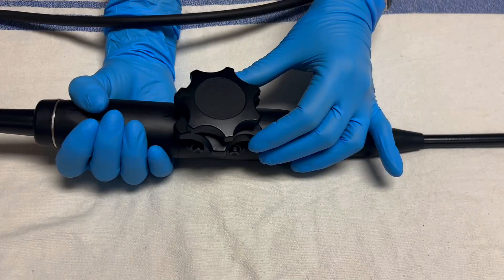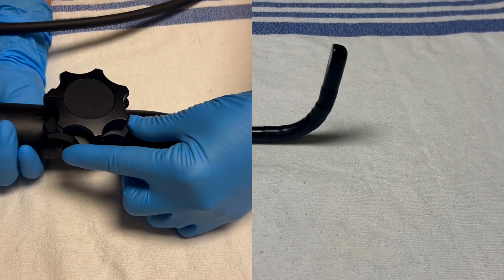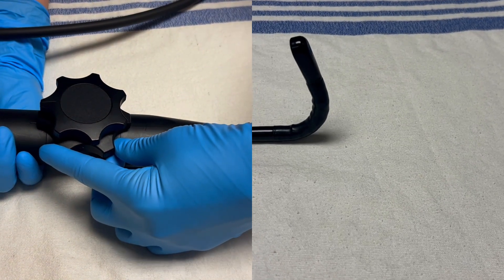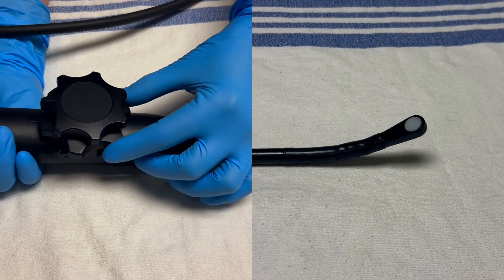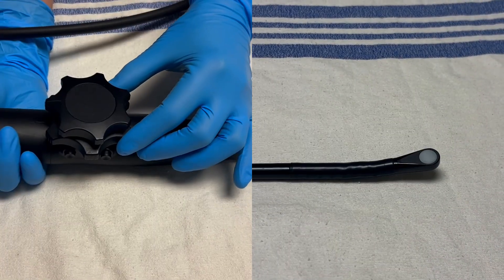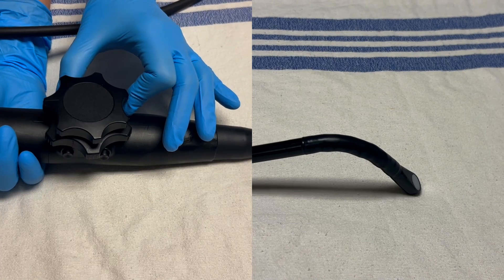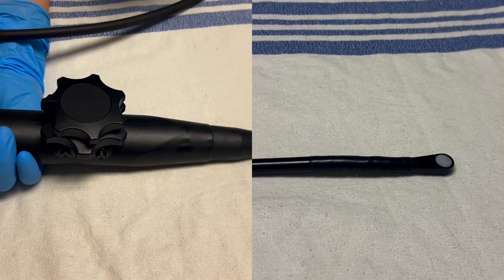The first cardinal movement is anti- and retroflexion. To anti-flex, place your hand on the inner or larger wheel and rotate clockwise. As with all cardiac ultrasound, make slow and gradual movements. To retroflex, bring back to the neutral position and then rotate counter-clockwise. With both anti- and retroflexion, please be mindful of the esophagus and take care not to damage it.